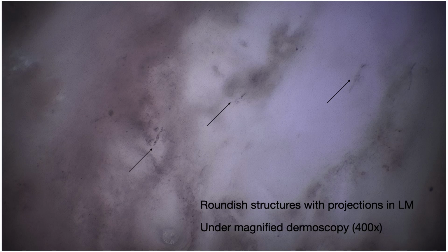And here a picture, a little spot on the magnified dermoscopy, the 400 magnification that was taken in the same patient, and you can observe the rounded structures with projections in this lentigo maligna.